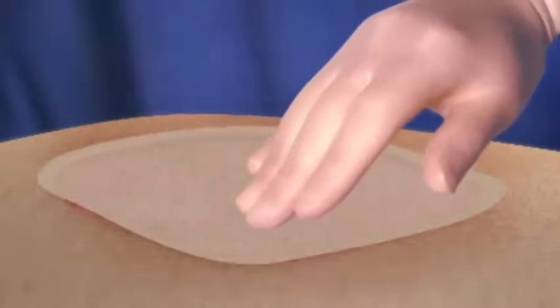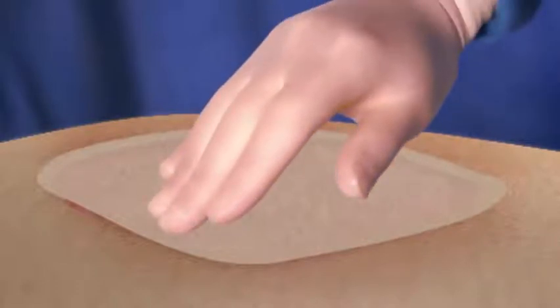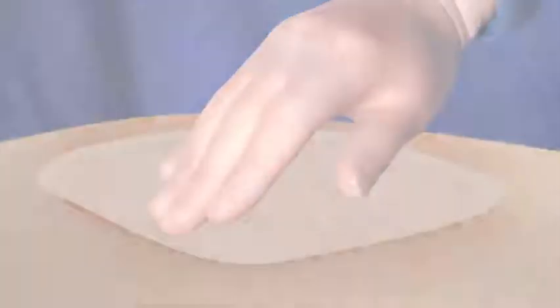After the flap or graft has been positioned, gently compress for at least three minutes to ensure Artis sets properly and adheres firmly to surrounding tissues. The solidified fibrin sealant will reach its final strength approximately two hours after application.